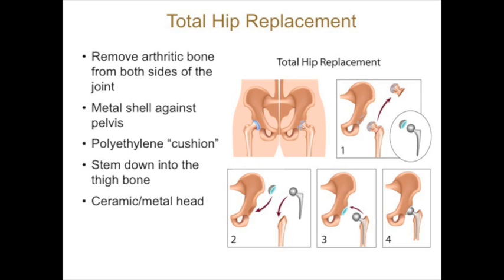A polyethylene liner is typically used, but the other options, as Dr. Shields mentioned, are a ceramic liner or a metal liner. Both have kind of fallen out of favor. And then the head ball can either be cobalt chrome, which is a metal alloy, ceramic, or another special metal called oxinium, which is commonly used as well.